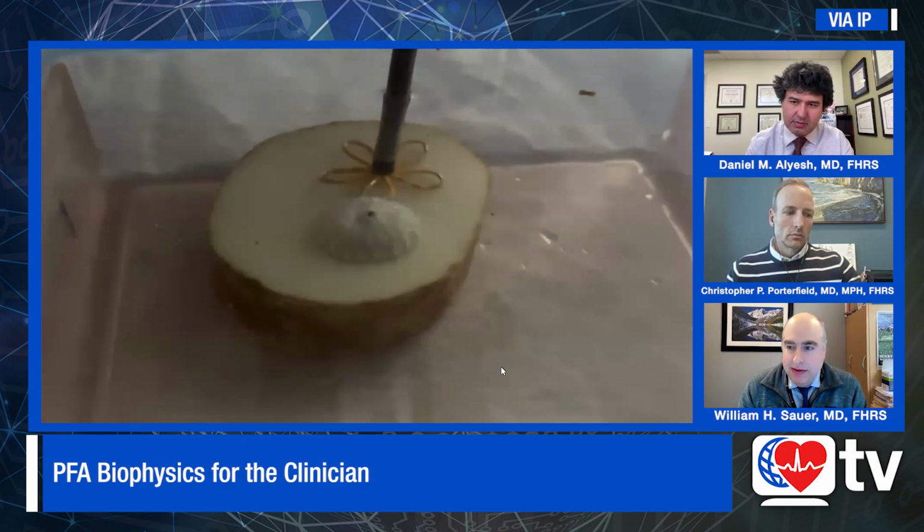I think this is going to be a rare event. You have to be touching the metal or really close to the metal, or maybe in between two poles in a bipolar configuration. You might see this if you have that cobra formation that occurs with this catheter, because electrodes can touch other electrodes, and that's sort of what we're seeing with arcing. Thankfully, we have safety mechanisms that help prevent delivery of energy in that circumstance. But metal affects the flow of radio frequency energy, and it also affects how PFA energy is delivered. It's something that's going to come up as we get close to pacing leads or stents, and it's one of the things I'm interested in studying.